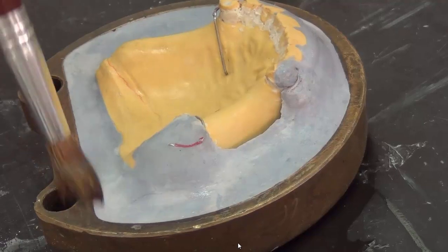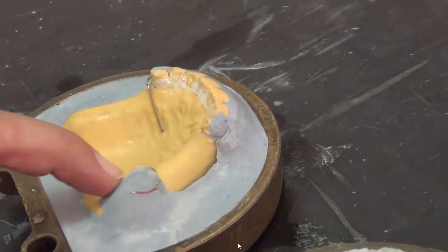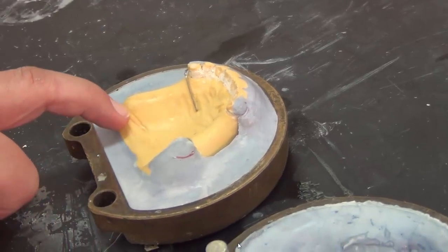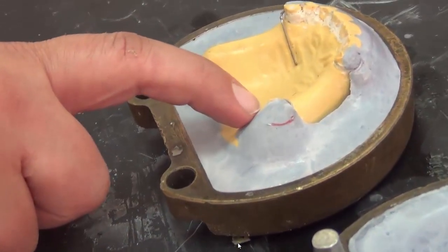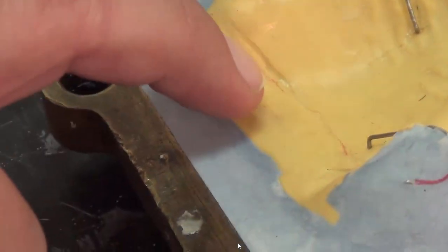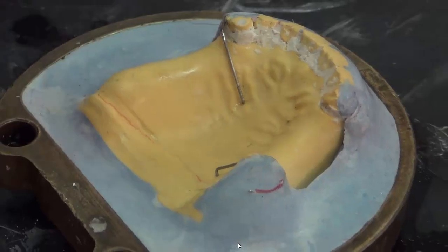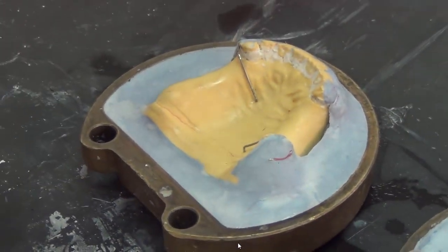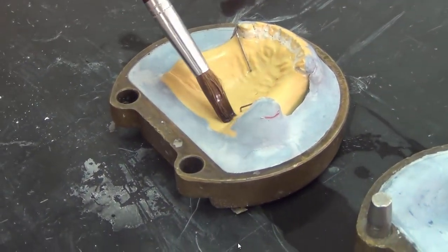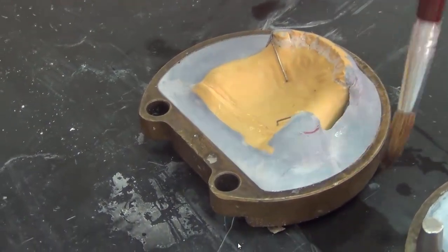Now for those that did not do a post-dam beading step, we can come in and do a beading line. We see that the beading line here is clear. It's similar to the post-dam we have in dentures. So we want to make sure that we have a good beading line. If you have not done the step previously, this is the time to do it. And then over it we place our separating medium. Okay, so this is ready from this side.